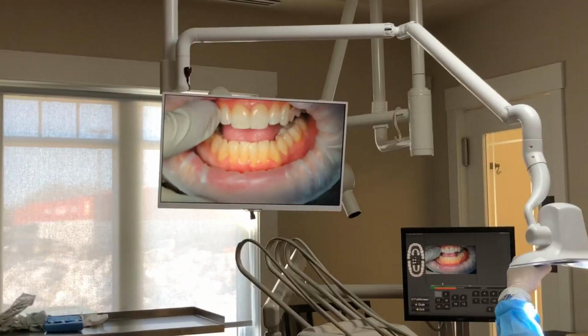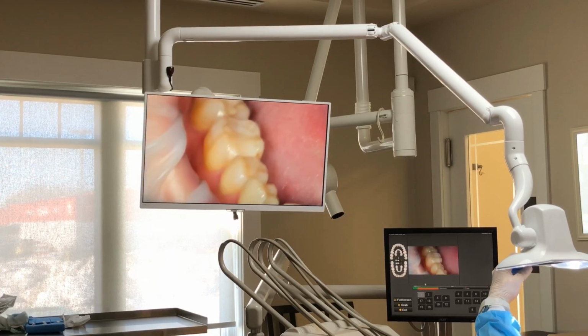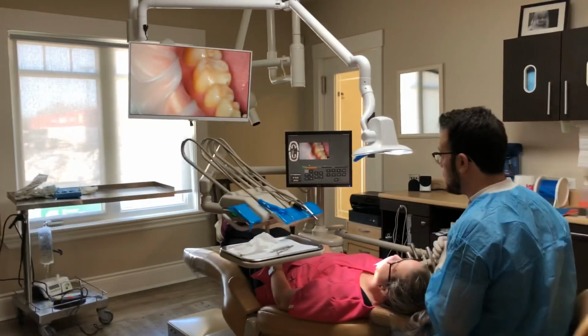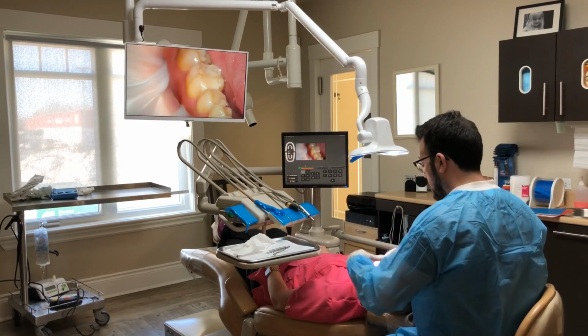If I want to zoom in, open wide, and on a particular problem in the posterior, I can zoom in and go in direct view, direct or indirect, and freeze the image. So very flexible, very quick to take all those intra and extraoral photos or videos. And I'll remove this for now.